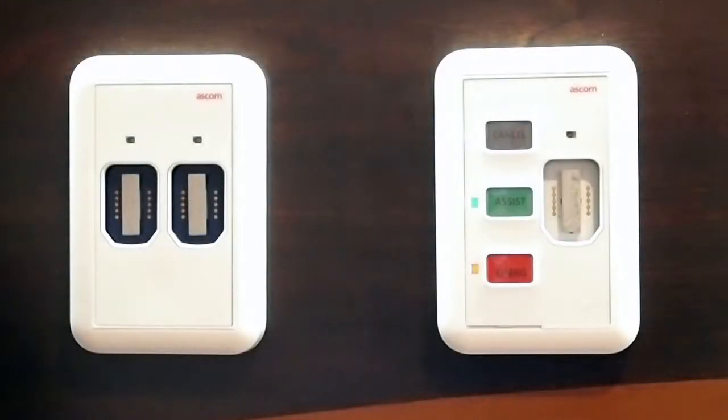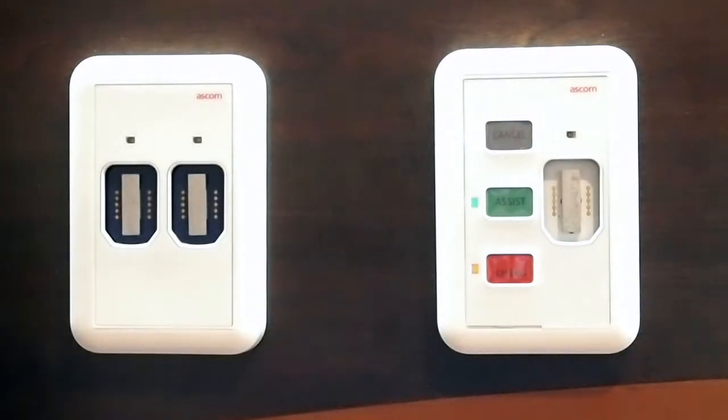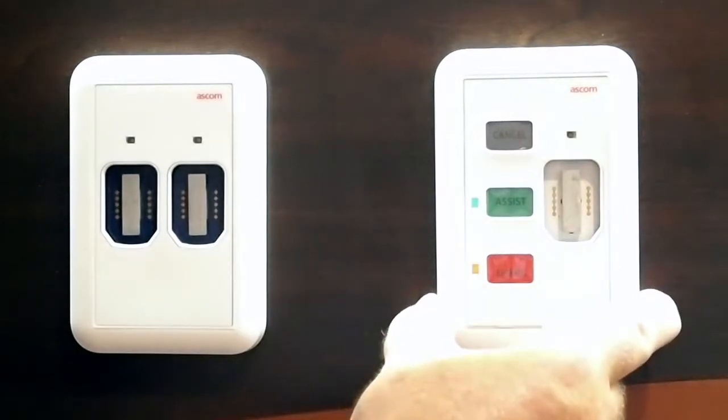Hi, my name is Jeff McCormick. I'm the Director of Product Management for ASCOM North Americas. I'm going to give you a quick overview on one of our Telligent 6 devices. This is called a bedside module.